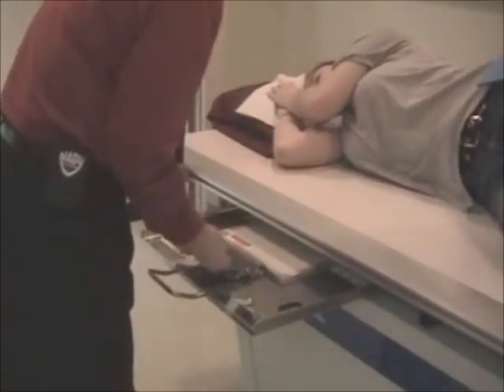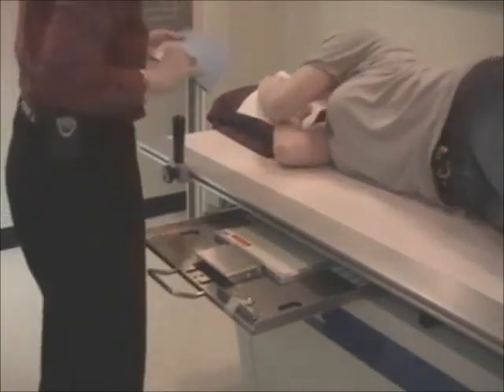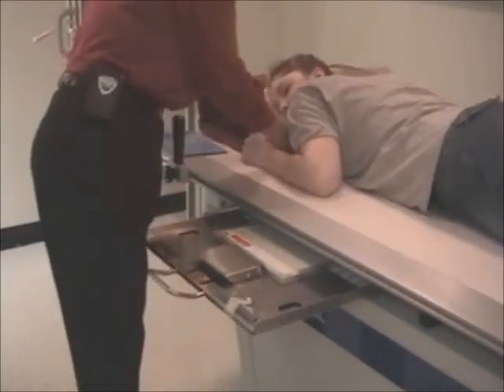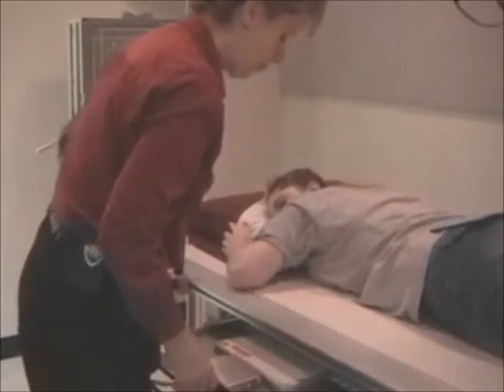and I'm going to go crosswise, and we're going to have the patient roll onto their stomach. And they're going to go into a PA position. Both arms up, both arms down.